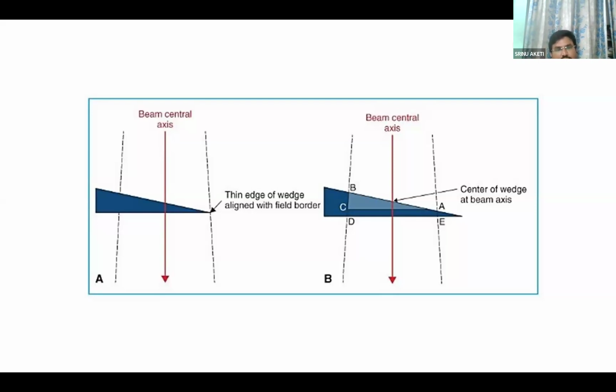So this way, in Elekta, we use a motorized wedge of 60-degree. With its help, the open beam and wedge beam combination creates the required wedge effect. So in Elekta, any wedge angle from 0 to 60-degree I can create. If I want 29-degree, I can create. If I want 30-degree, I can create. Even 32-degree, because it is based on the open beam and wedge beam combination. Understood? For example, if I keep 25% wedge and deliver the remaining 75% open beam, then it will be a 15-degree wedge. If I kept 75% of the beam-on time with wedge and the remaining 25% open field, then it will be a 45-degree wedge. Understood?